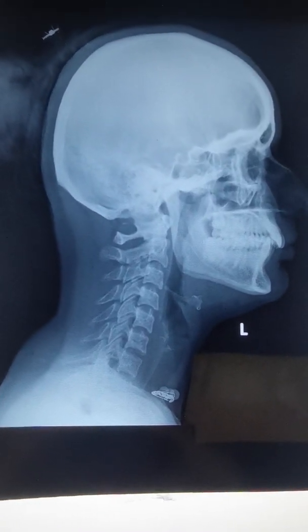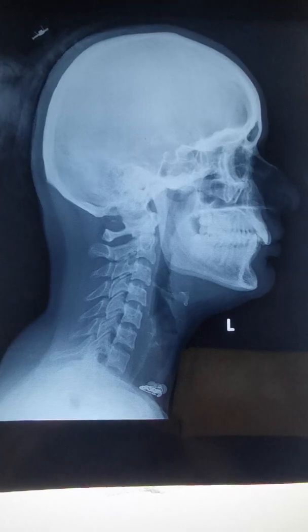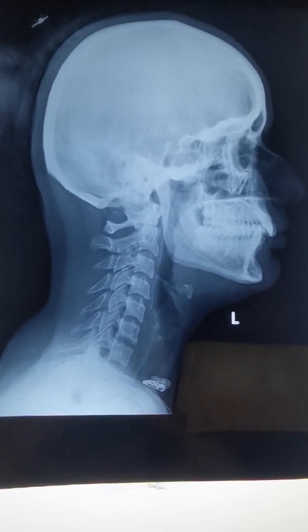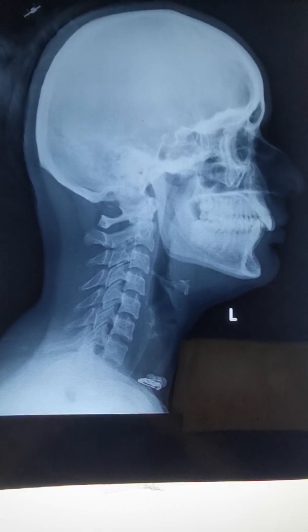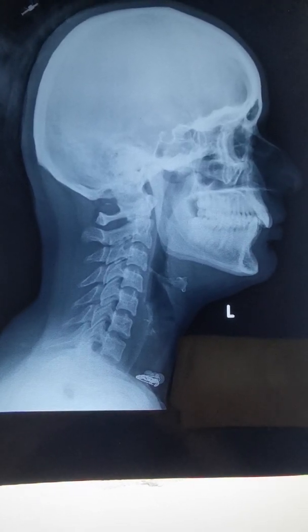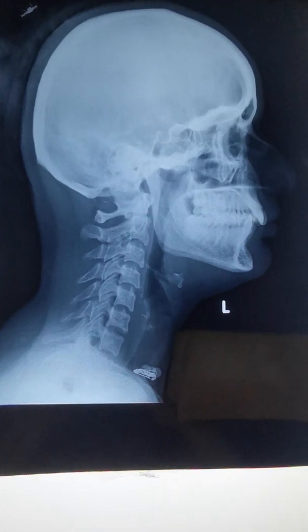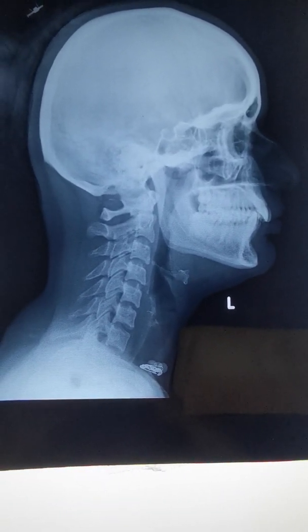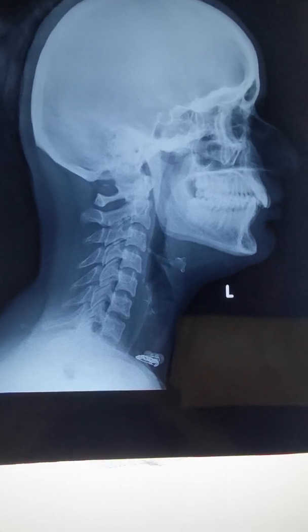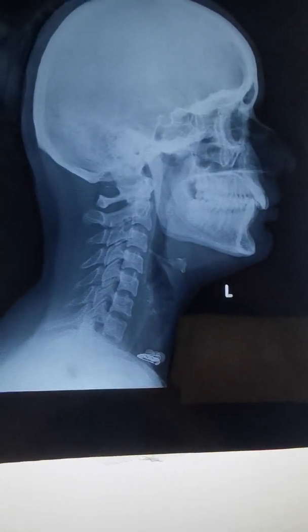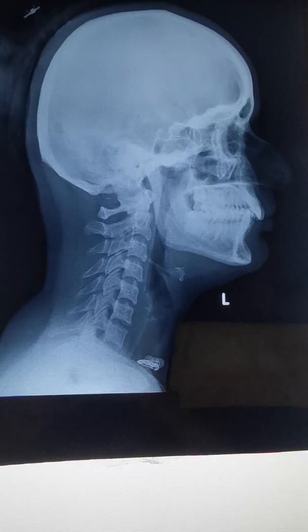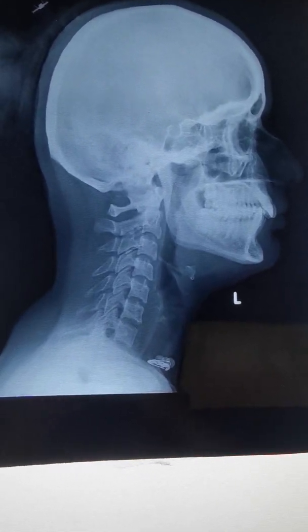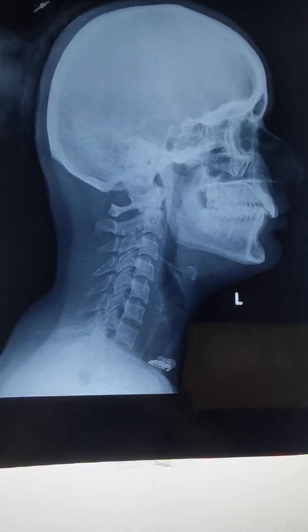Hello guys, today in this video we will discuss an x-ray which is also called a lateral cephalometric x-ray. As you can see here, there is a radiograph of a patient — the patient's name has been hidden because of confidentiality. This is a lateral cephalometric x-ray, or you can say a true lateral view.